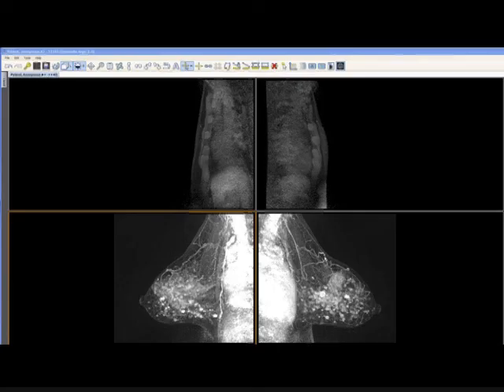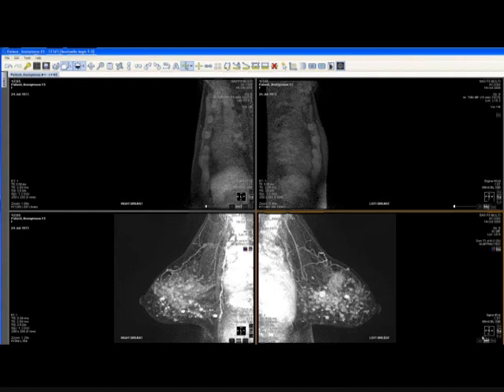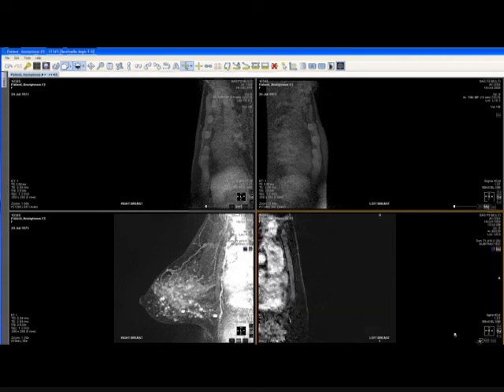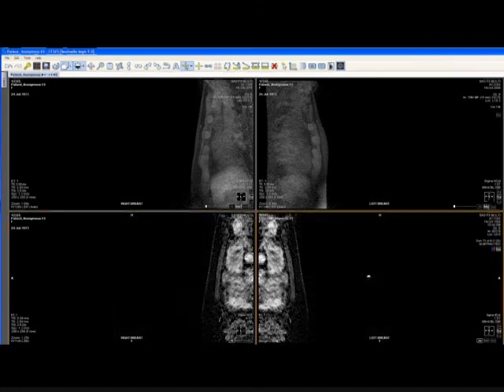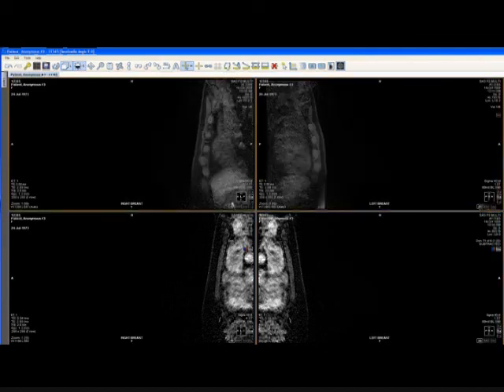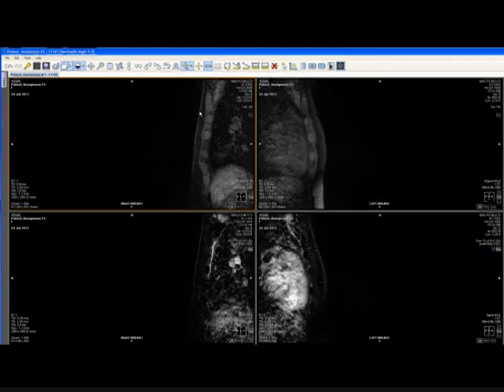Neither of these were true in this case, and so then we're just faced with this really difficult appearance of the breast. The best way to approach this is, you basically have to analyze each lesion as best you can. Look for something differentiating from the rest of the nodules. When you see this diffuse multinodular enhancement, it, much like mammography, is often going to wind up being benign. But you obviously can't make that assumption, so you do have to analyze each lesion as you go through.